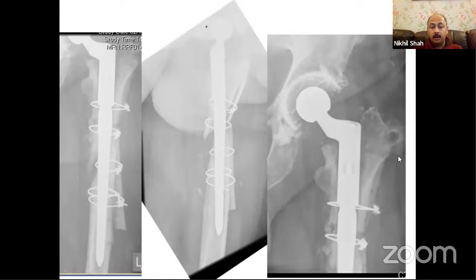So see what has happened now at follow-up in about 3 months. The proximal femur has actually disintegrated because of the various fracture lines going through it. So the assembly of the tube has not worked very well, but the distal fixation has stayed very stable. So the patient is completely asymptomatic and he's mobilizing well, but we know that the proximal fragment is no longer gripped by the stem. And this is, I think, what Sanchit was trying to highlight.